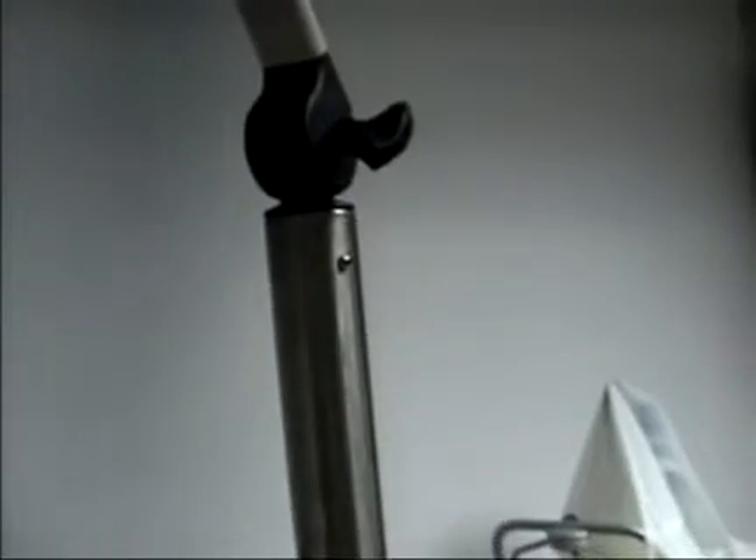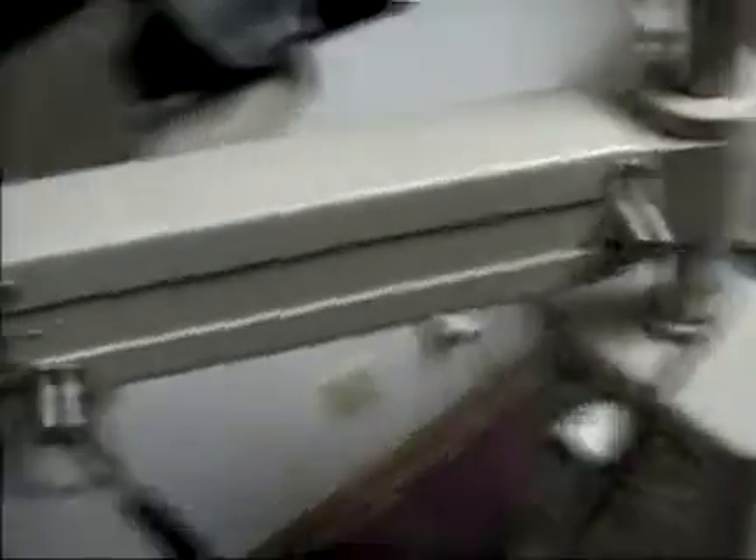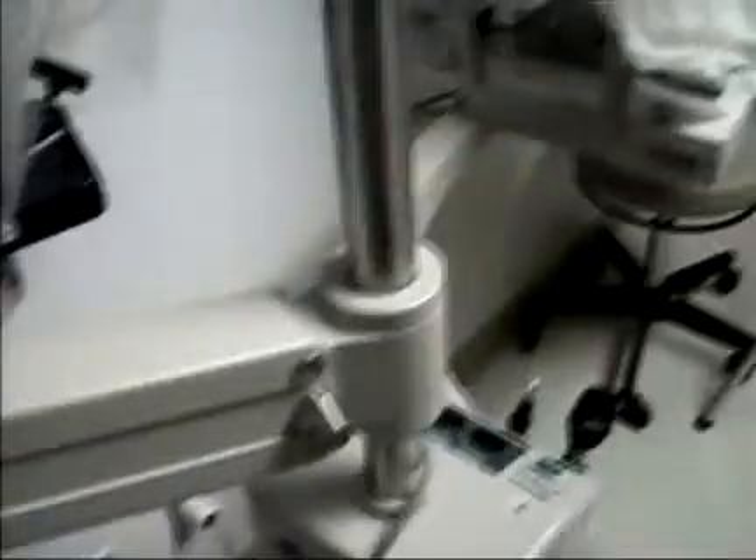To remove or replace a phoropter arm, you need to remove everything above it on the pole. Lighting typically is the main thing. If you remove a keratometer arm, then you've got to remove not only the lighting but the phoropter arm, which would be sitting above it.